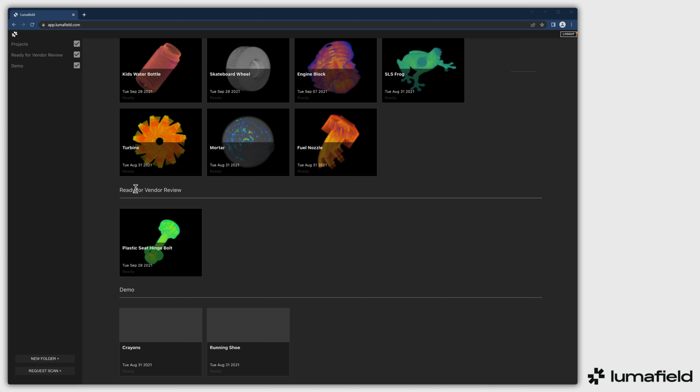If you mistype or misspell anything, you can rename the folder as well. Go ahead and right click and you will see options to rename.